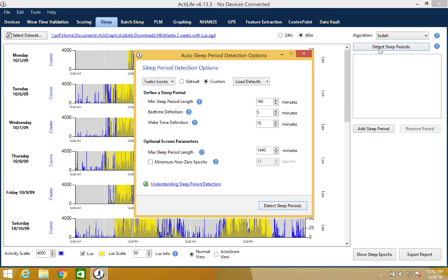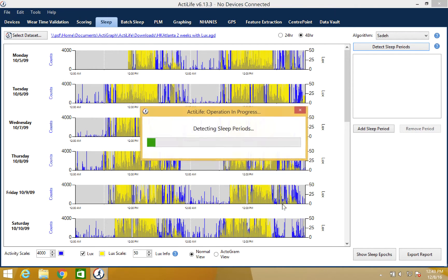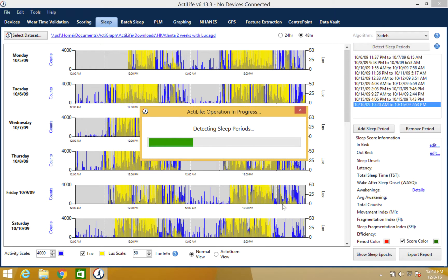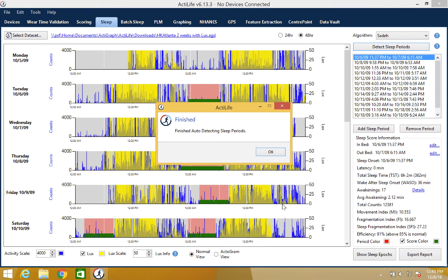Once you select detect sleep periods, you can then select the algorithm of your choice, or you can set your own custom parameters. Now select detect sleep periods and the system will automatically detect and score each sleep period.